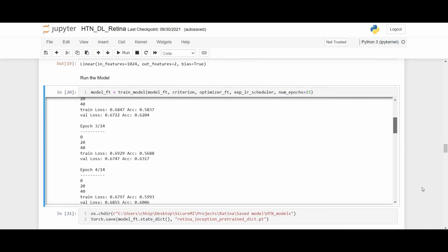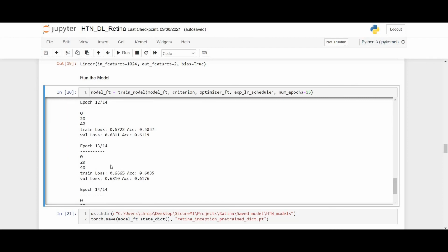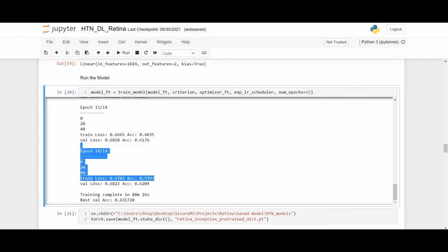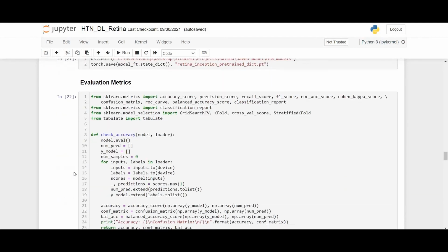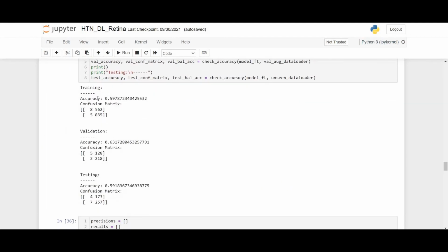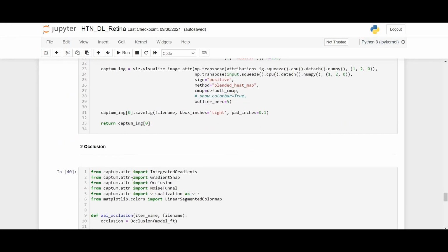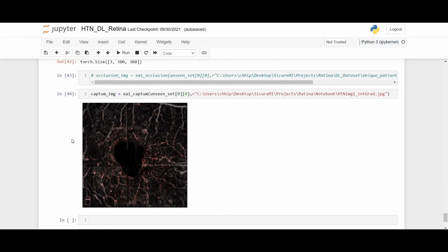For the performance of the deep learning model, we can see the training epochs, training, validation, and test accuracy of the model. We can also have a look at explainable AI. In deep learning, where researchers cannot explain why the model arrived at a particular decision, explainable AI helps to understand, interpret and trust the predictions made by the AI models.